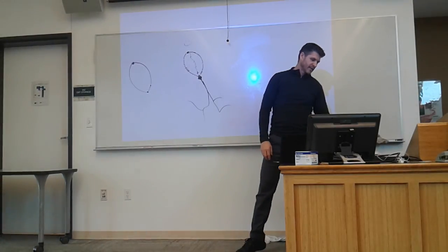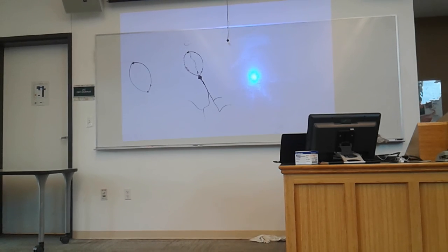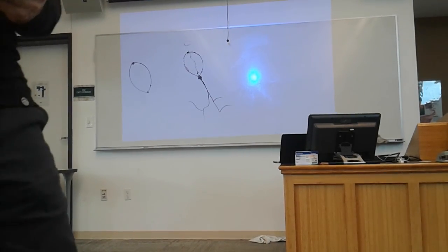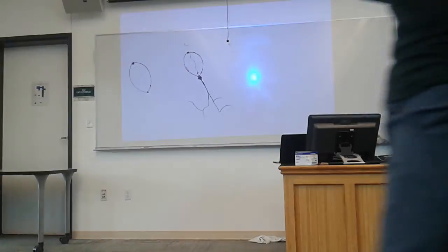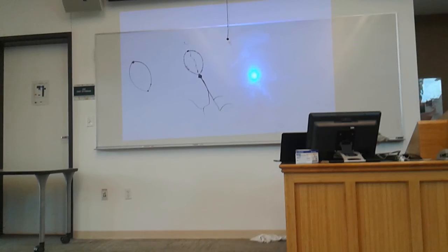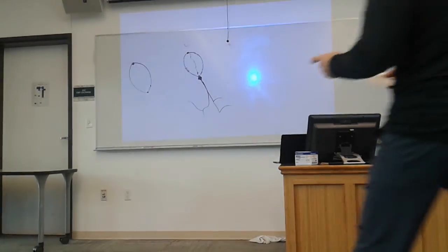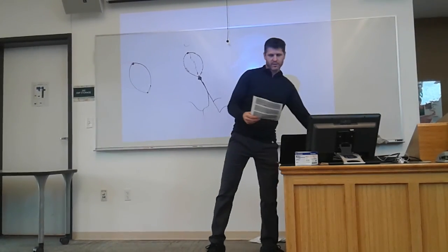So the key characteristic to this rhythm that you just saw, which was what we ended up on last time, is a flutter. The key characteristic that you see with a flutter is an atria that's firing all the time, never creating a moment of baseline. So as you look through, all of these are examples of a flutter. All of those are examples of a flutter. And they're burying the T.